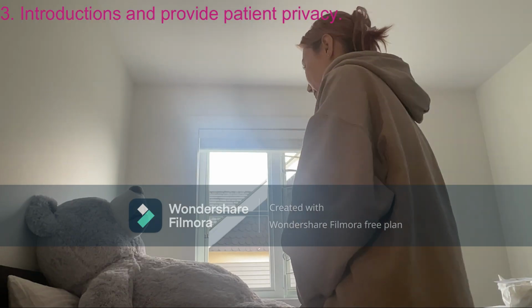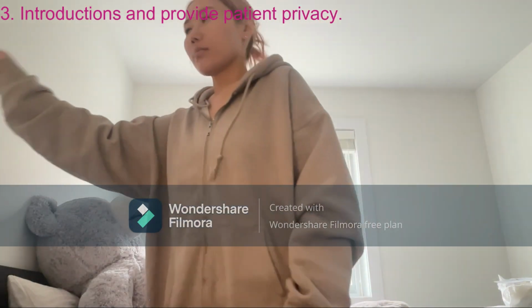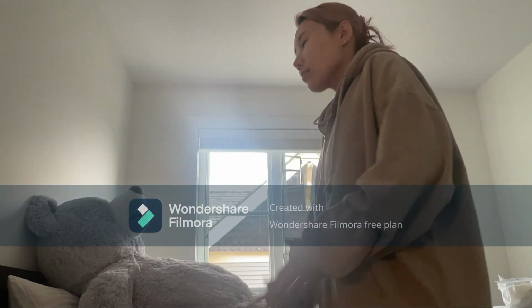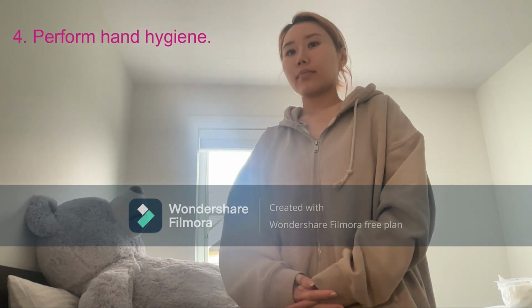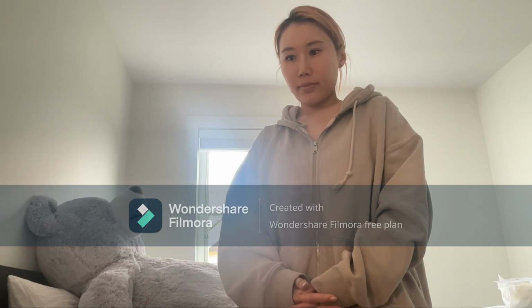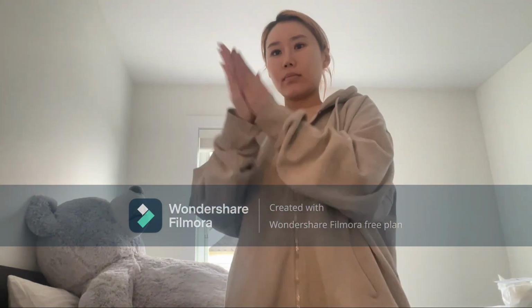Nurse will introduce themselves as a student nurse and provide the patient privacy. Nurses play a critical role in preventing and treating UTIs by implementing infection control principles. This includes practices such as hand hygiene, properly disinfecting equipment, and using sterile techniques during procedures. So, Yvette will be performing hand hygiene.